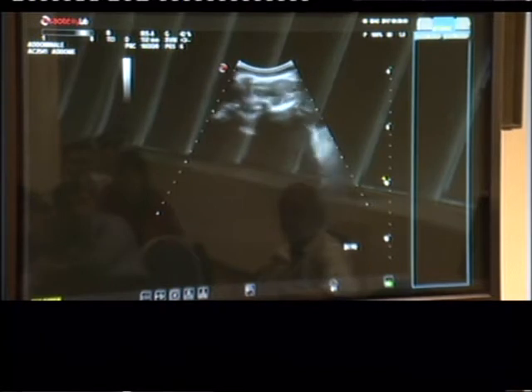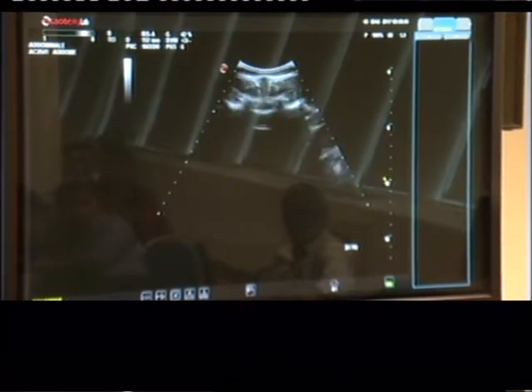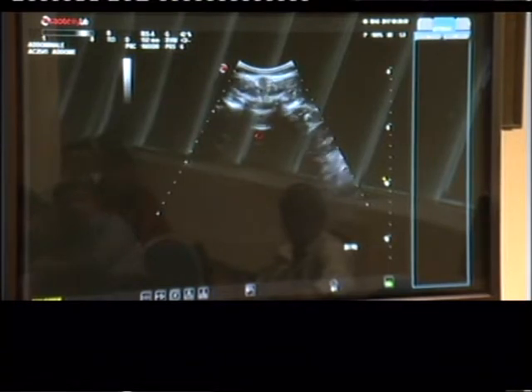And then we go back, and we see the middle. So what is this? Posterior longitudinal ligament. And what's that little line above it? The dura. So that's the anterior epidural space. And then the ligamentum flavum is here. And then this is the dura here. Okay.